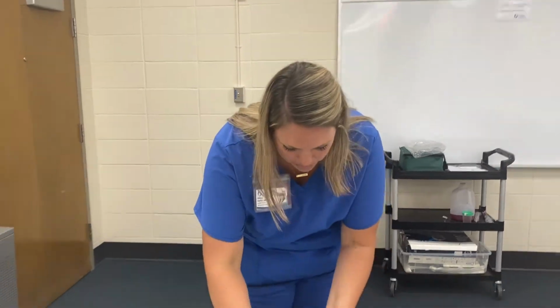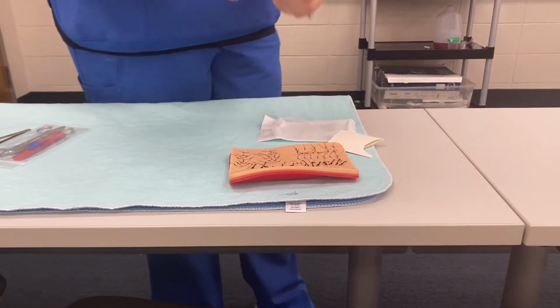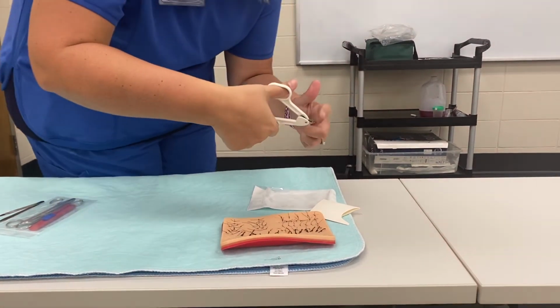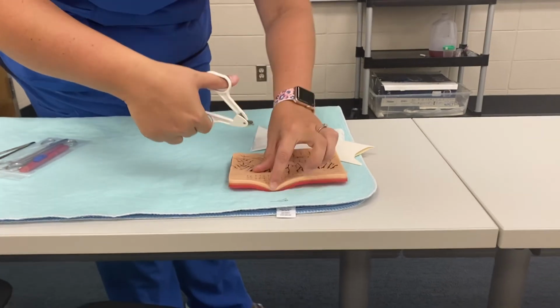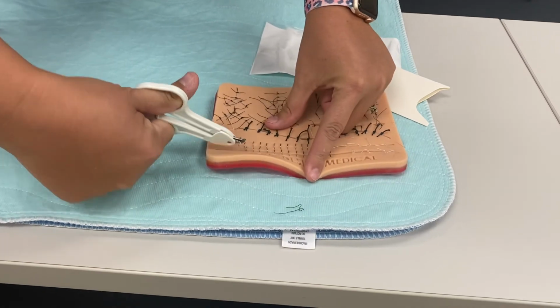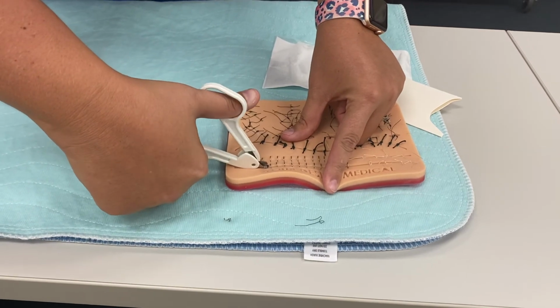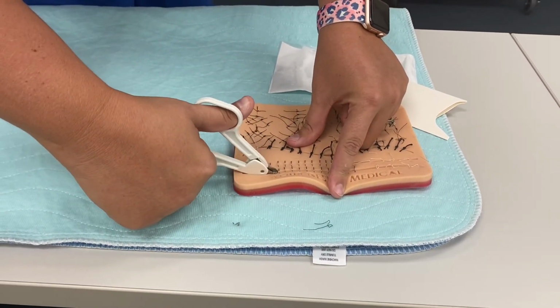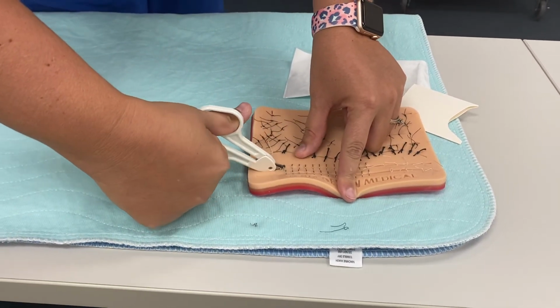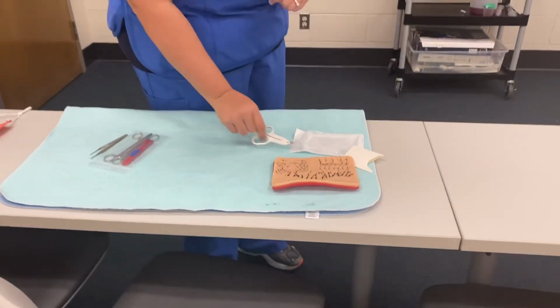For my staples, I have a staple removal kit that comes with these fun looking staple removal scissors. I would want gloves on, okay? It has a piece on it, and we'll show you all this in lab when you get to practice, that I am just simply going to go under the staple, close my scissors, and it removes the staple. Sit it to the side. Go to my next one, put it under it. It's harder on a mannequin. Let me do this one. Squeeze, and it removes it. The key is I need to keep count of those and make sure I dispose of them properly.